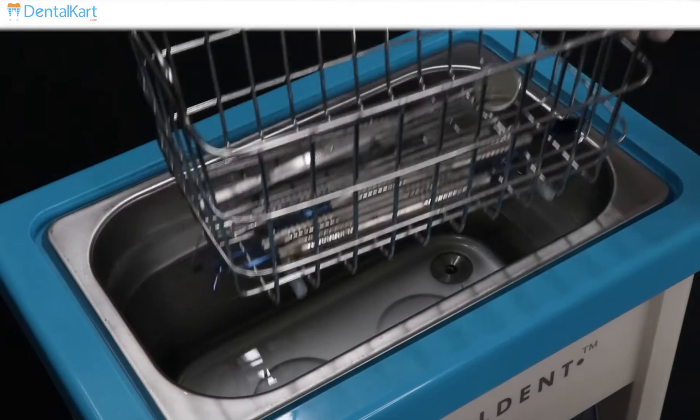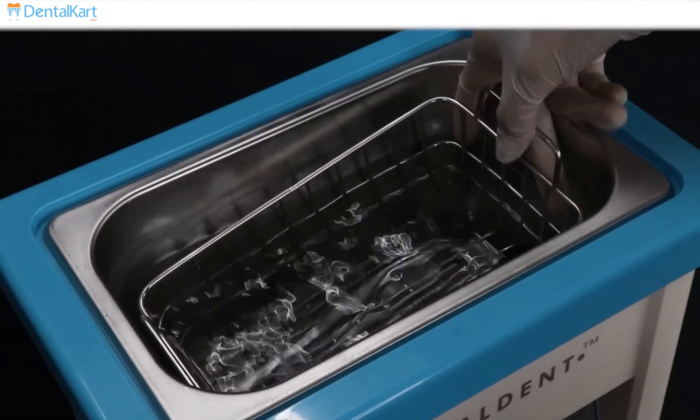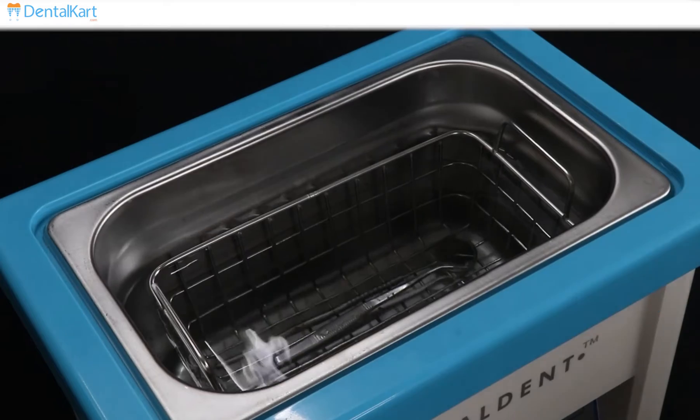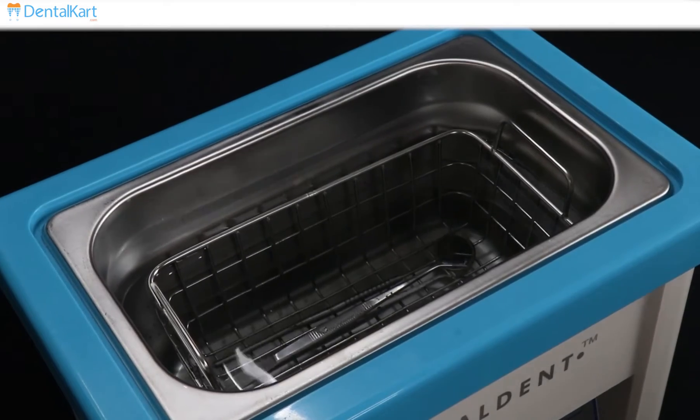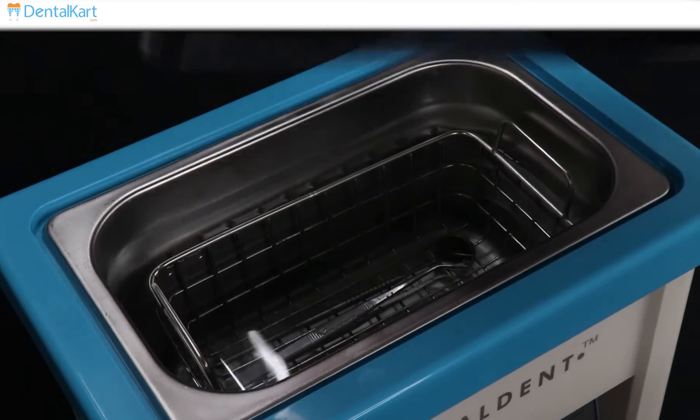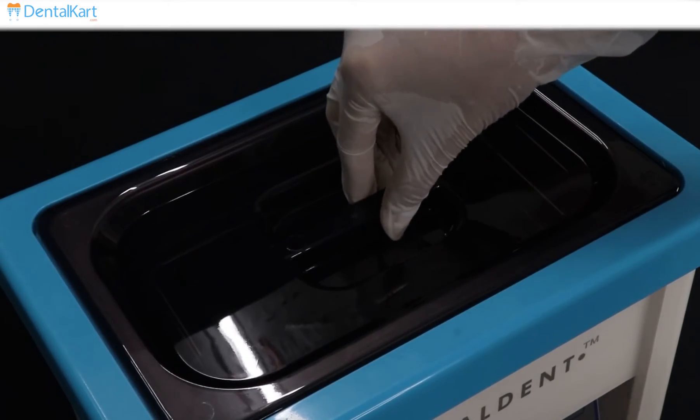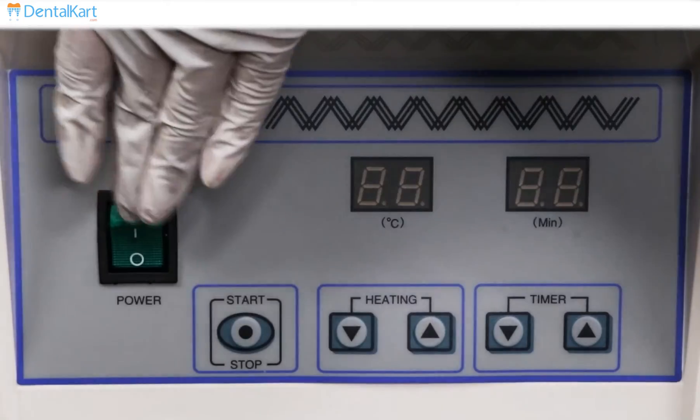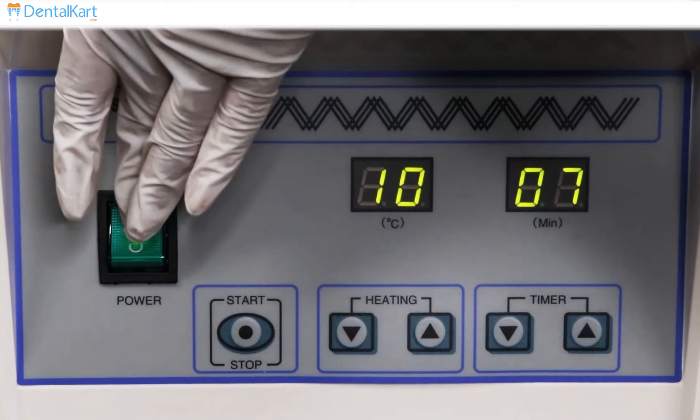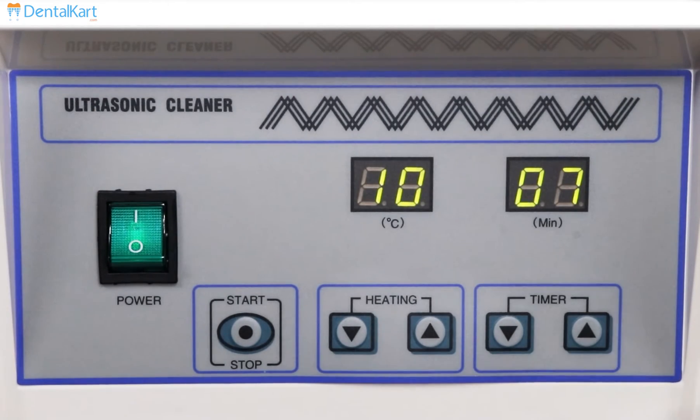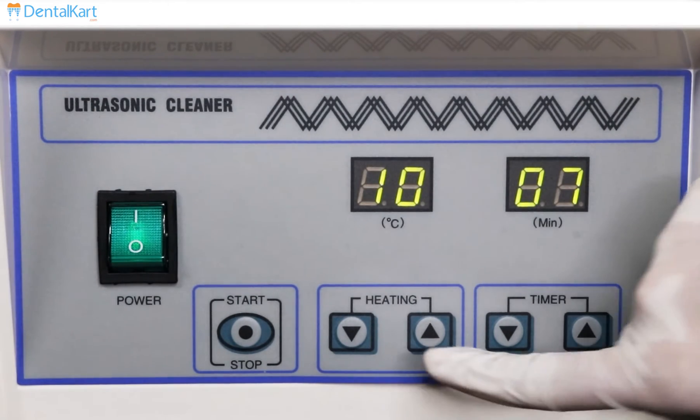Put the basket into the bath and close the lid. Press the power button and set the desired time and temperature and press the start button.